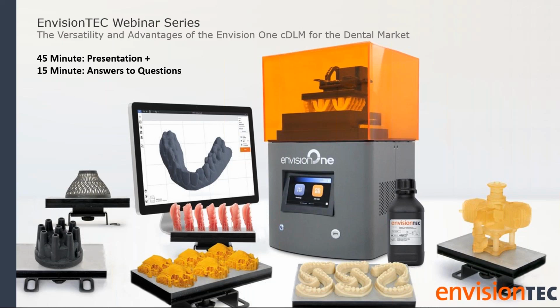So another question here: why are some models shorter than others? This is all dependent on the lab, honestly, and the way that the lab works. I know that some dental labs have fine-tuned their crown and bridge models, basically cut the fat, made them as lean as possible so that you're only printing what's absolutely necessary. These labs have also made their models hollow, cutting away material from that solid model and printing only the hollow models.